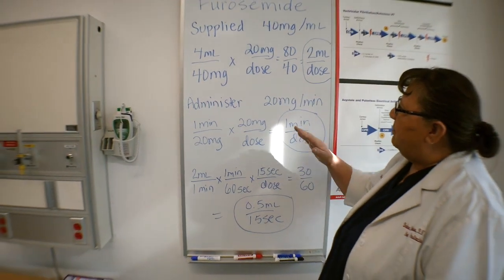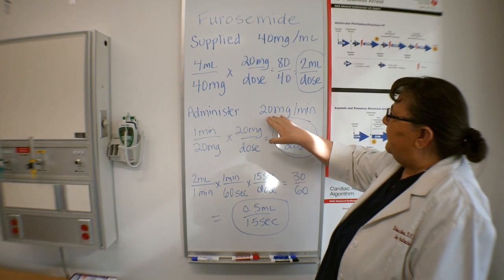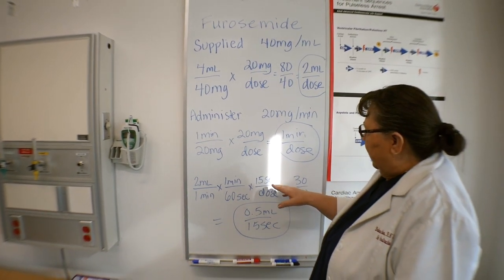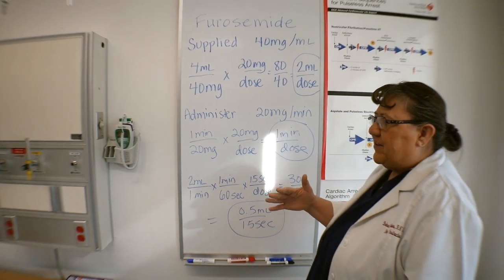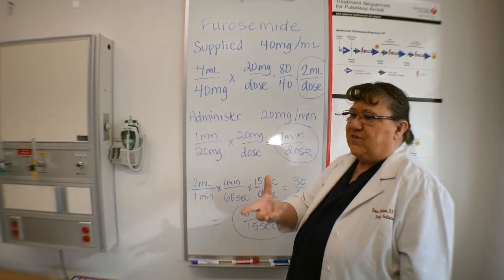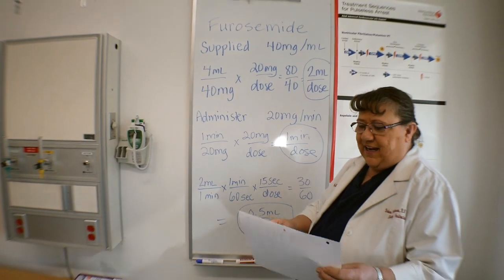So each drug will be different based on how much you're drawing up, if it has specific recommendations for time, and we'll spread it over the whole time evenly. So I'm going to demonstrate that in the rest of the demonstration with the hands-on on how to do that evenly looking at the medication.